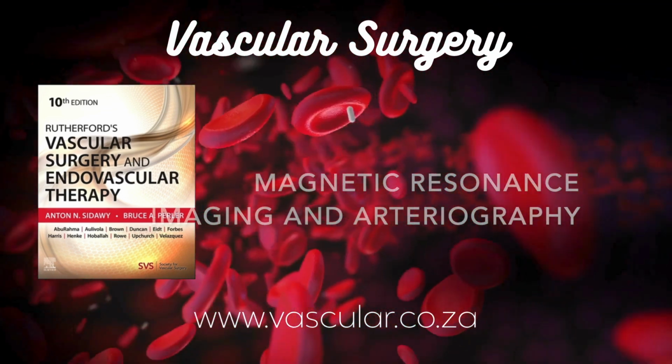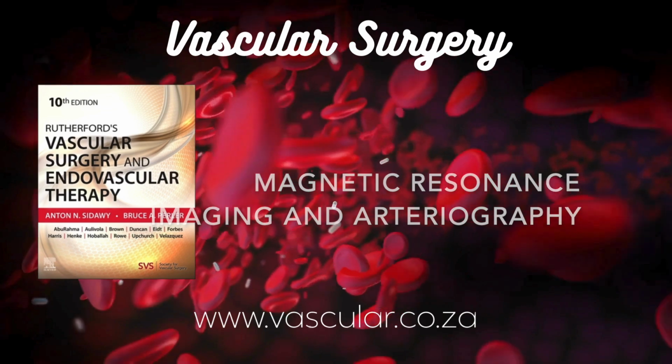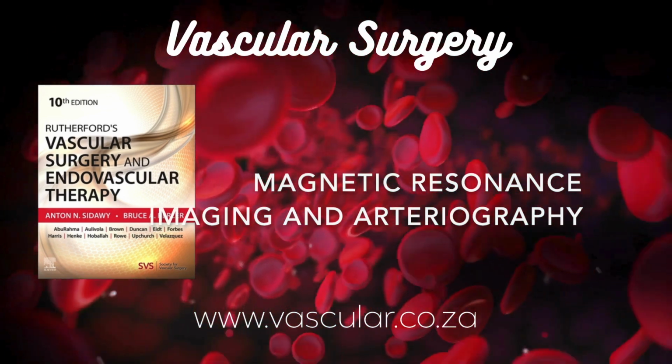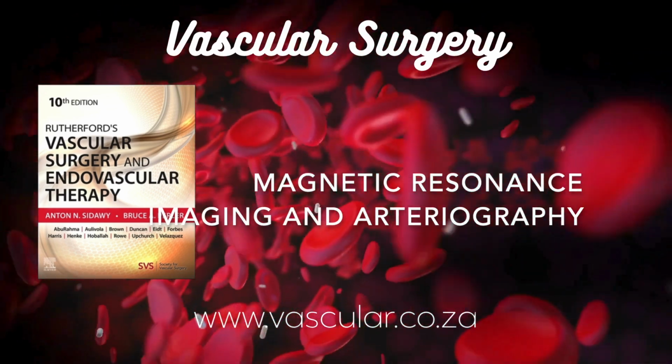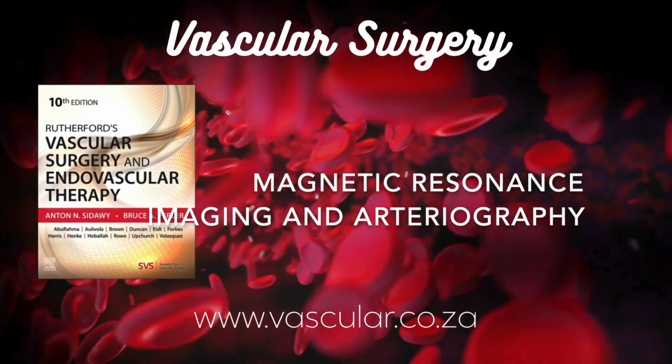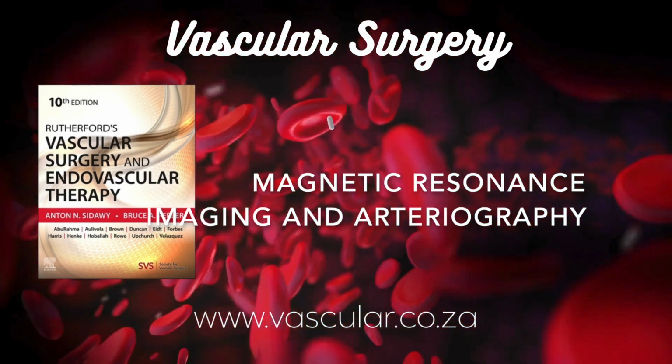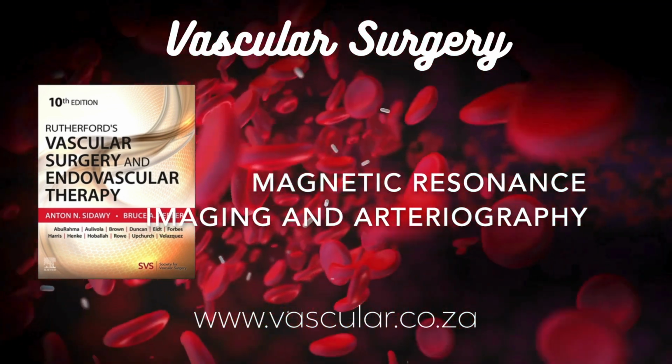It's great for evaluating the aortic arch. Some even argue it might be better than other methods for certain things there. Like what? Diagnosing aortic dissection, which is a tear in the aortic wall. Assessing aortic aneurysms, those dangerous bulges. It's also key for monitoring patients with conditions like Marfan syndrome that weaken the aorta.